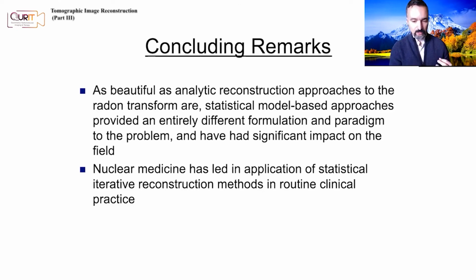And in routine clinical practice, statistical iterative recon algorithms have been applied for quite a long time now, and increasingly so. And more and more in recent years, the value of this has been realized in other practices, such as in CT imaging, where switching from filter back projection type algorithms to statistical recon has been a major frontier in the CT world, resulting in improved image quality and or reduced dose and things of the sort.